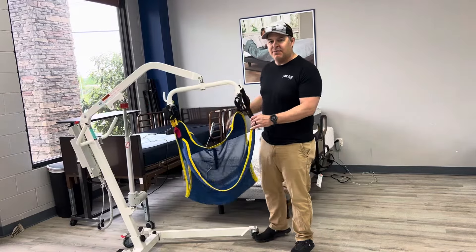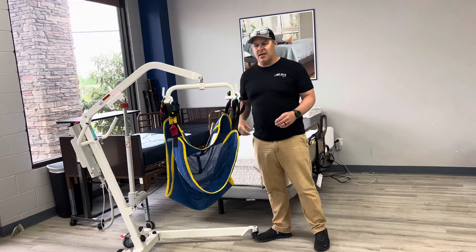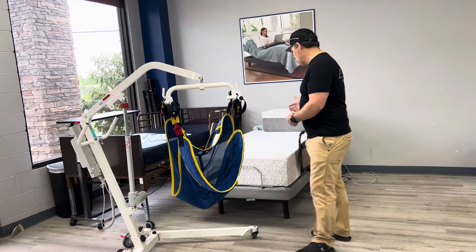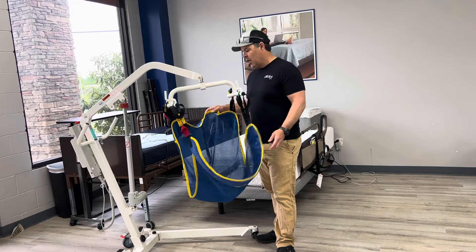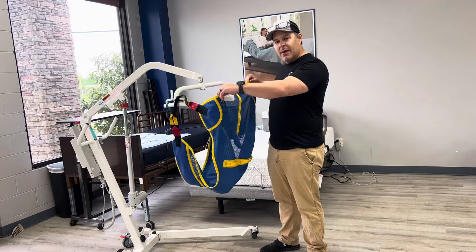For those of you that don't know, this is a patient lift. They make them electric and manual. This is a device that allows you to take somebody out of a chair or wheelchair, put them in a bed or another chair, and lift them up. Basically in a hammocking effect, you're able to move them around.